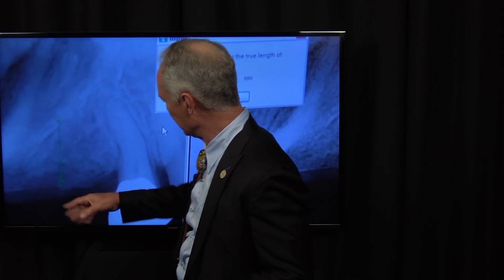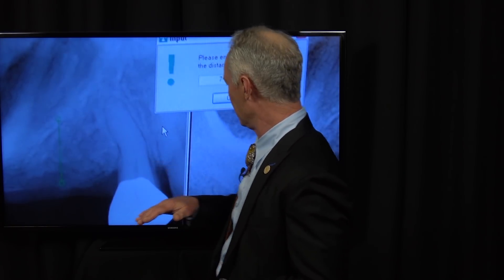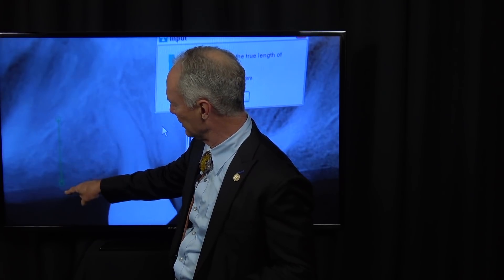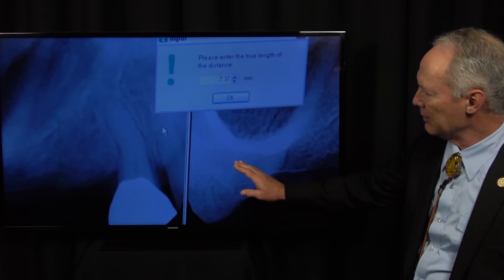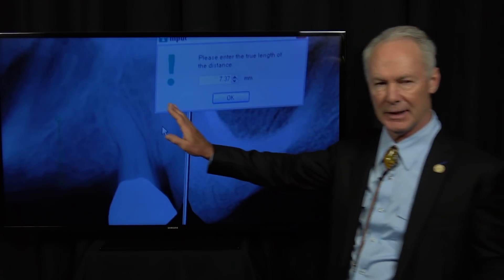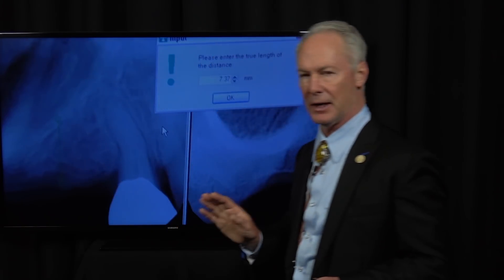After adjustment of the alveolar crest, I've got 7.37 millimeters of bone from the alveolar crest to the floor of the sinus. I'm going to talk about the issues with placement of the tip of a root form or small diameter implant into the sinus at the end of this presentation. I know I'm going to place the implant a bit into the sinus, but the bone in the floor of the sinus is very dense and that's nice stabilizing bone — don't worry about placing an implant just a bit into the floor of the sinus.